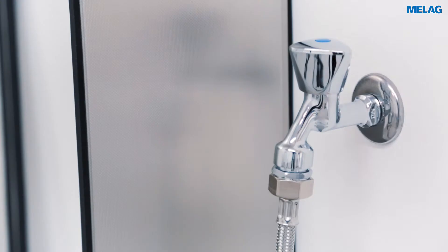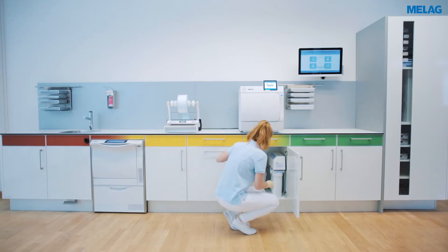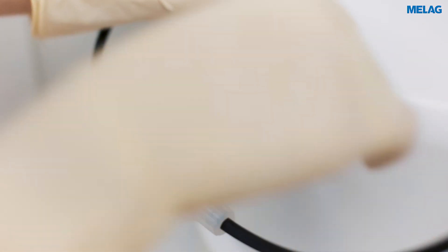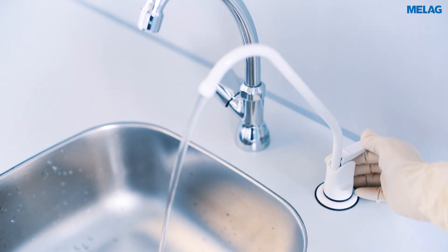Before changing the cartridge, please close the waterline tap and the pressure tank shutoff valve. To depressurize the system, please remove a little water with the removal valve.